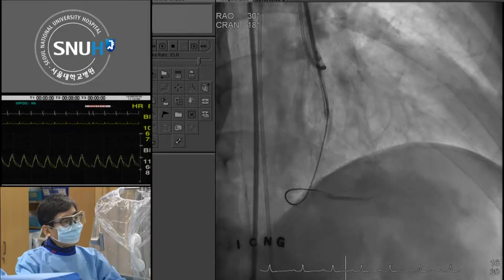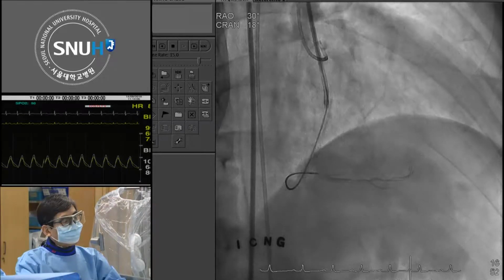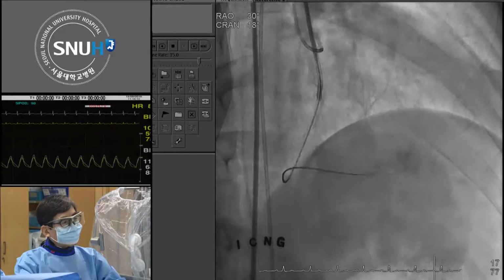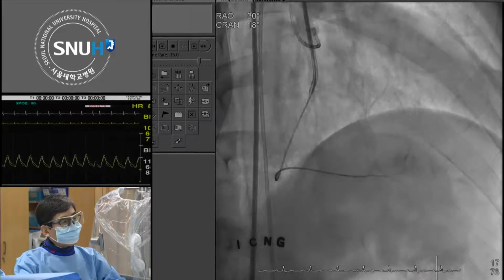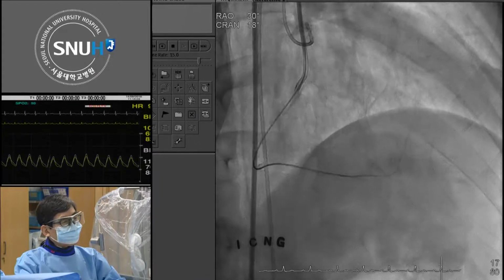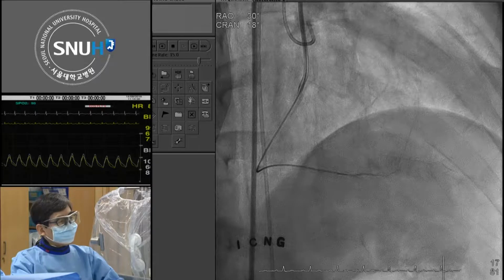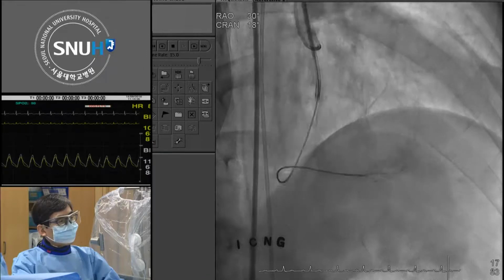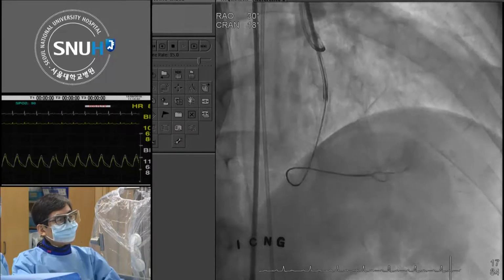Professor Kim, before you explain your progress to the procedure, I'd like to ask the panelists: it's the first time, which approach is better, do you prefer antegrade or retrograde? Actually, this patient already failed the antegrade approach, but this time your angiogram shows a fine tapered antegrade flow. We'd like to discuss that. Another attempt or retrograde firstly?